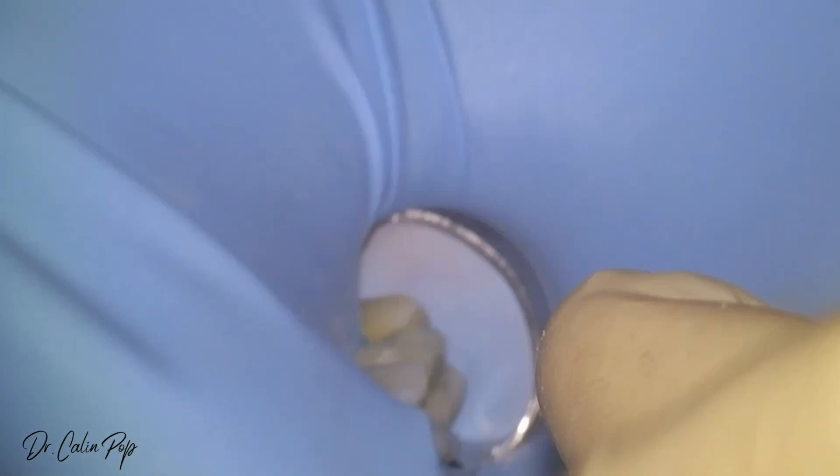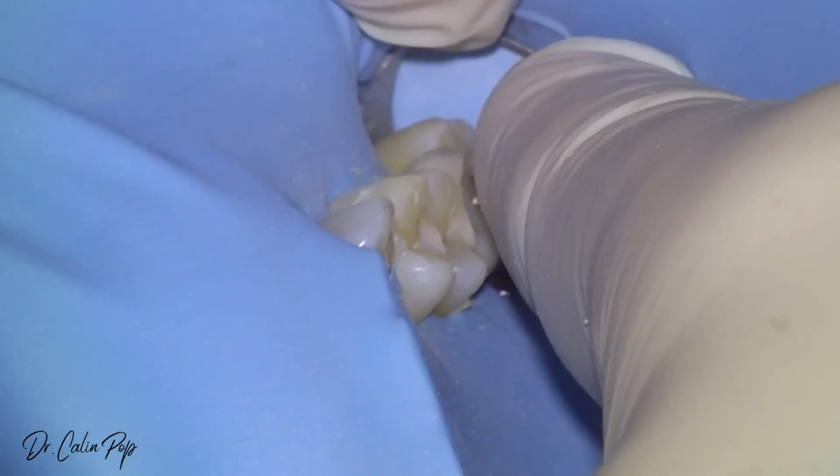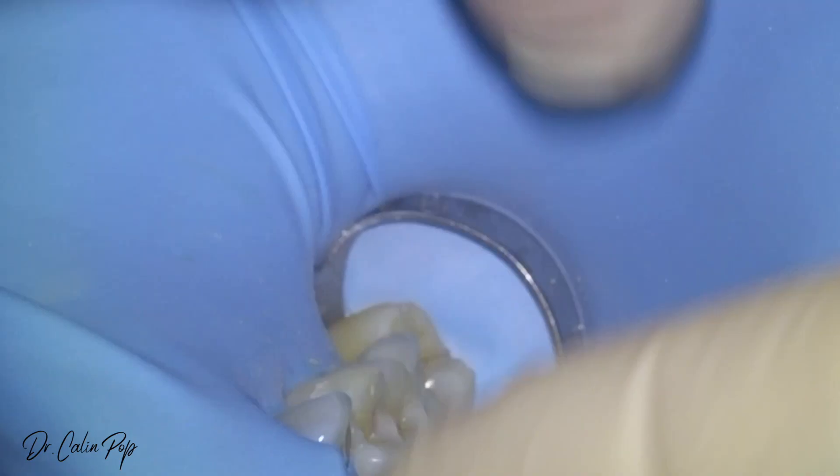So that's why — even when you insert the sheet, you should come from the middle of the mouth and go there. This is what I did actually, but it was too fast. When I insert, we can check the direction — but actually, that's not exactly true.